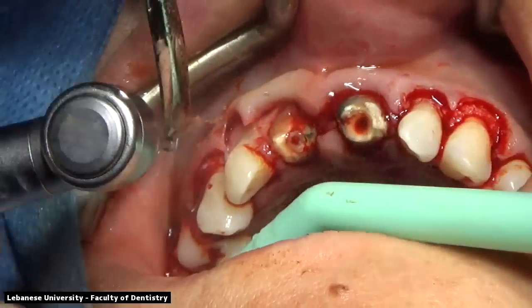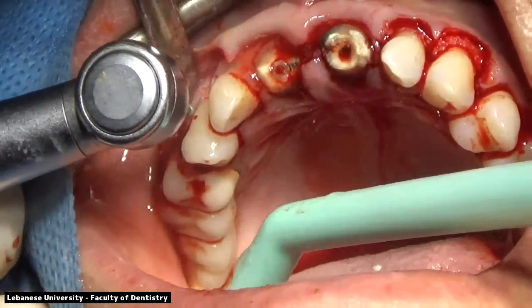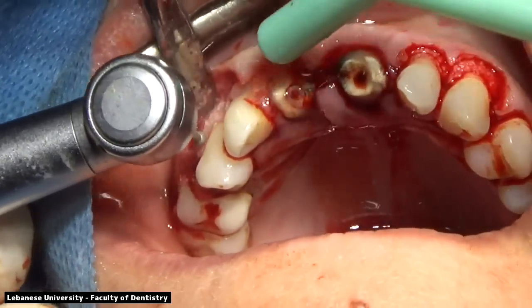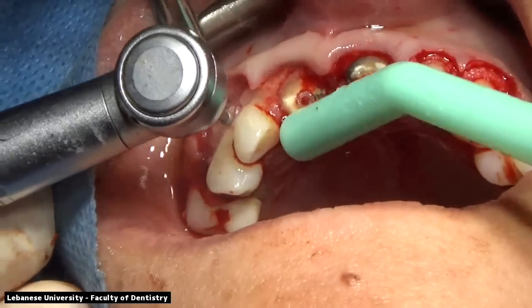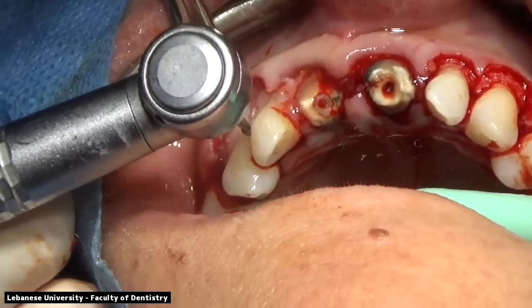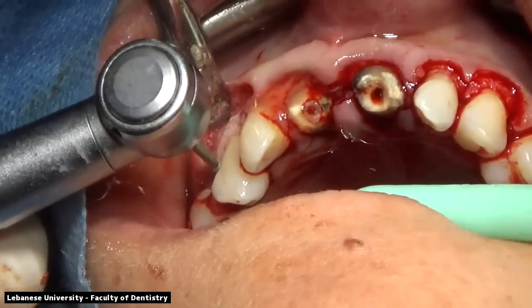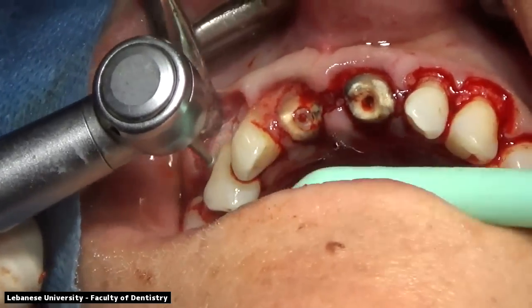Once we did our gingivectomy procedure with the soft tissue and removed the excess soft tissue, because we had a very wide band of keratinized tissue, we opened a flap. The bone sounding previously showed us that the bone level was at the cementoenamel junction. If we kept the bone level at the cementoenamel junction, we would get relapse and rebound of this tissue, thereby deeming our crown lengthening procedure not efficient.